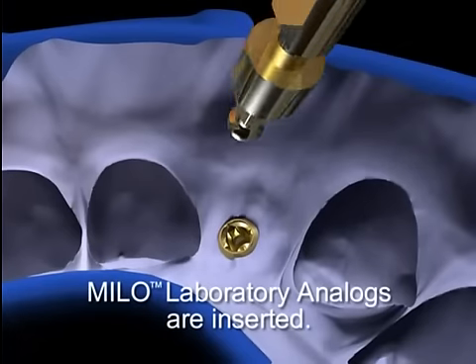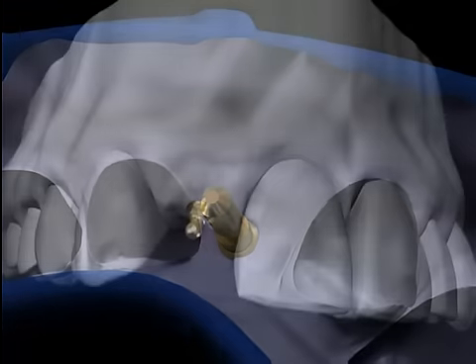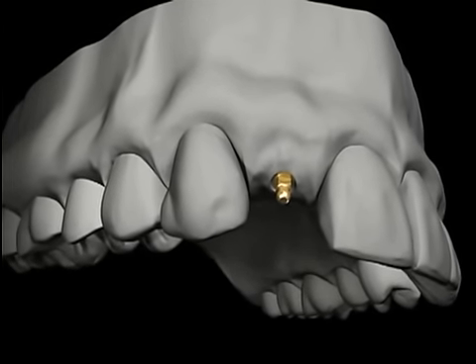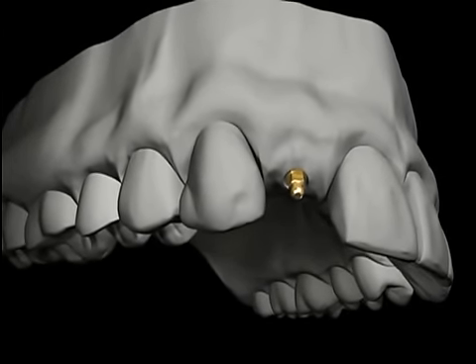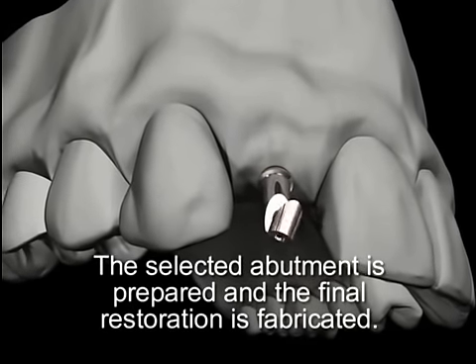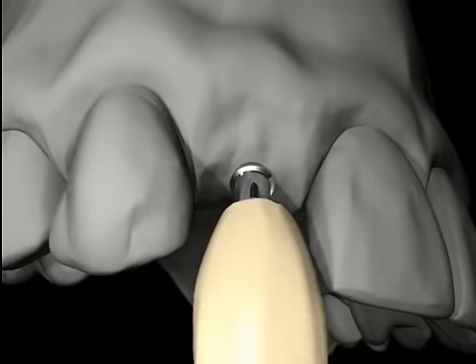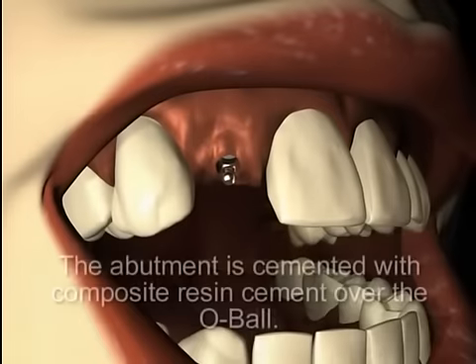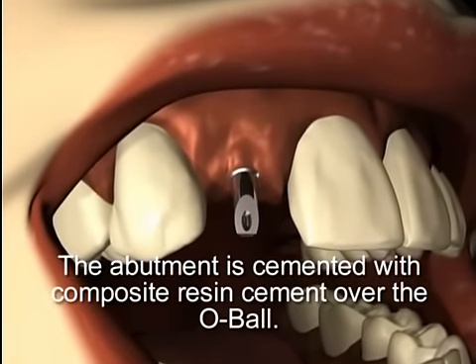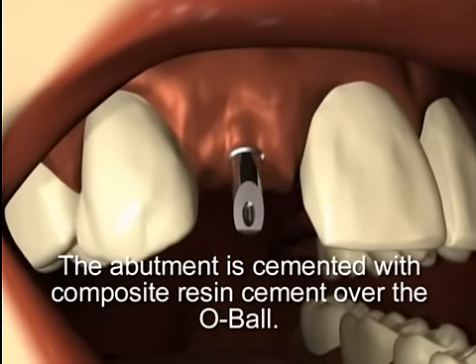MILO laboratory analogs are inserted into the impression copings. The working model is poured up. Appropriate MILO cement-over abutments are chosen for the restoration. The selected abutment is prepared and the final restoration is fabricated. The abutment and restoration are returned from the lab. The abutment is placed in the mouth and, if clinically acceptable, is cemented with resin cement.